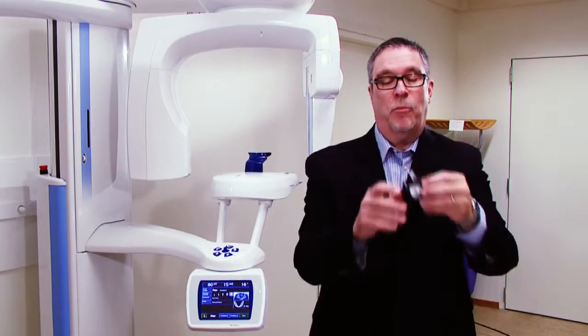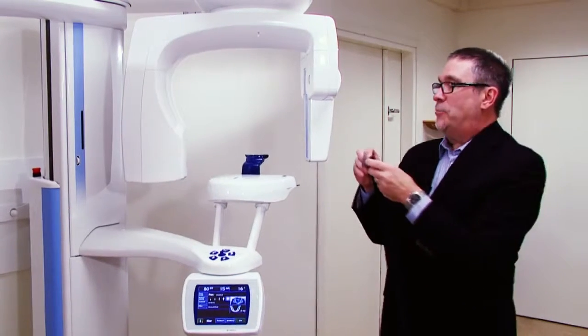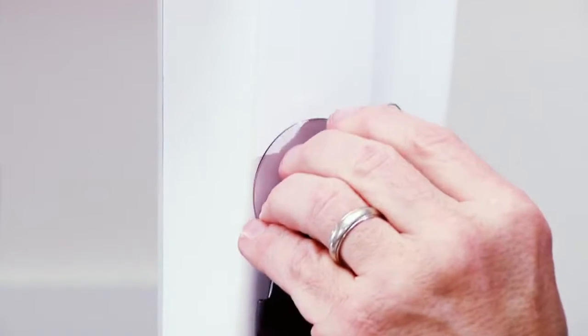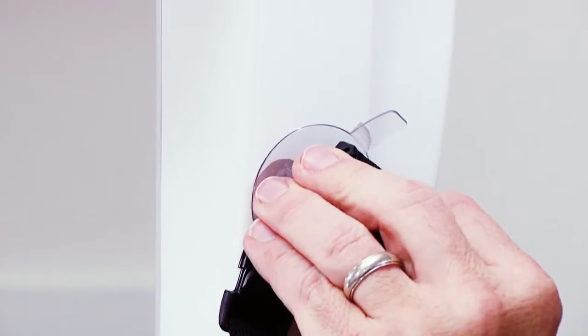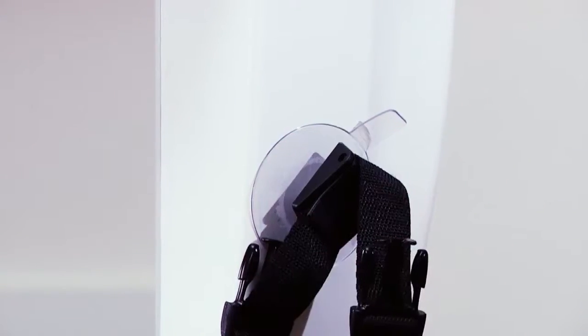You then take the suction cup portion of the holder, and you place it on the back side of the panoramic dental unit, anywhere where there's a flat surface, and simply press it into position.